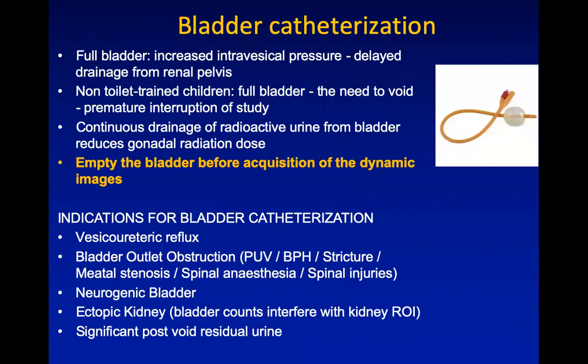Bladder catheterization. Now, this is on a case-to-case basis. If the patient can void by themselves, then all that is required is that the patient empties the bladder before acquisition of the dynamic images or the actual image. Because a full bladder can cause increased intravesical pressure with delayed drainage from the renal pelvis. In small children who are not toilet trained, a full bladder can cause discomfort. The patient starts squirming around and wriggling on the table. This causes movement artifacts in the images. You might even have to stop the study prematurely.